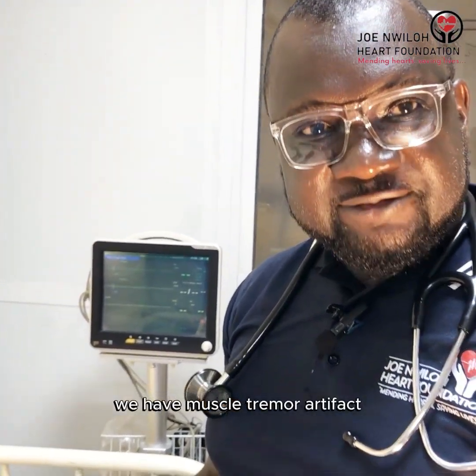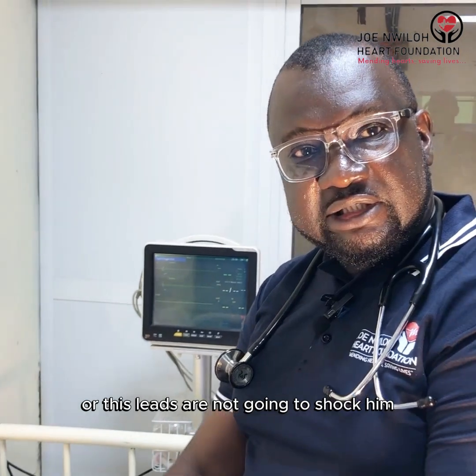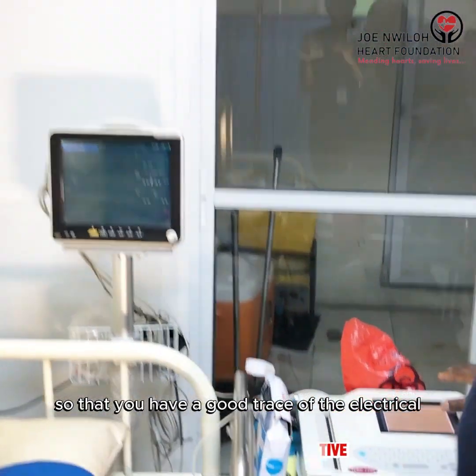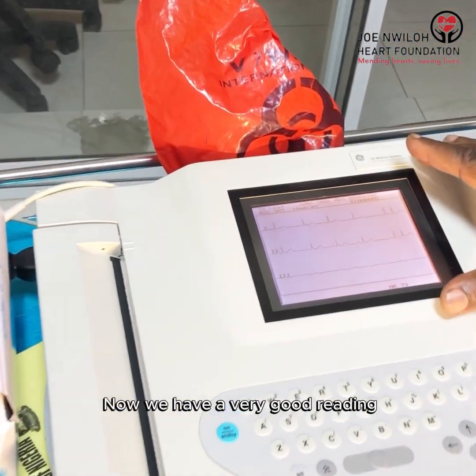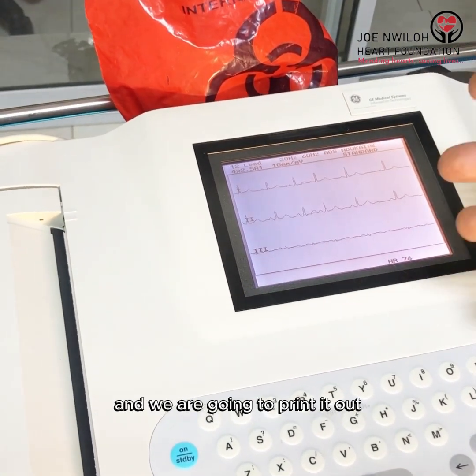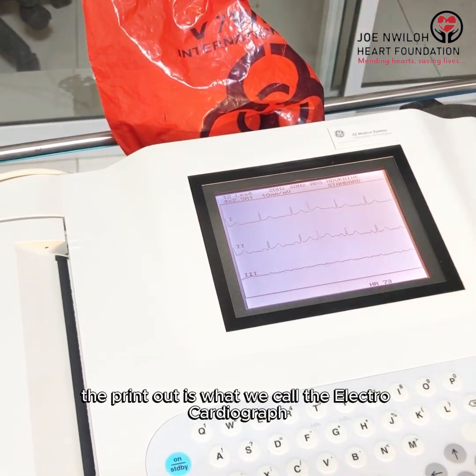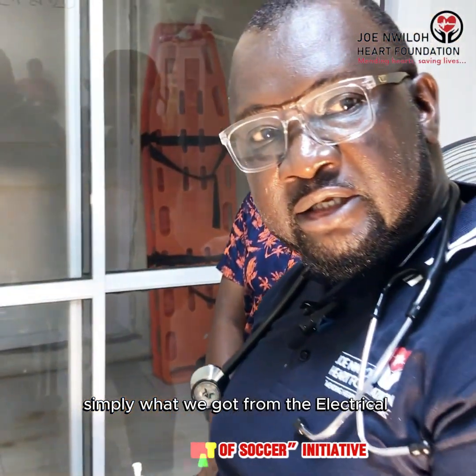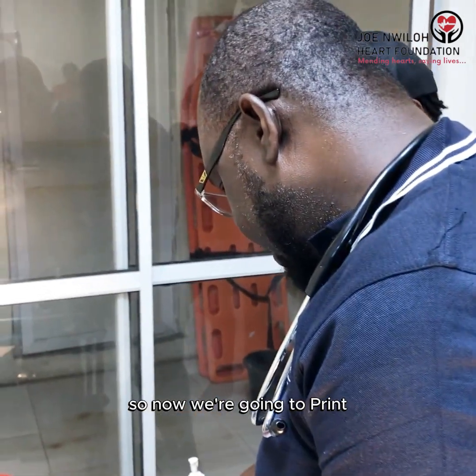We have muscle tremor artifact, electrical artifact. So when you calm the patient down, the patient has to relax, that these electrodes or these leads are not going to shock him. So the patient has to relax so that you have a good trace of the electrical reading from the machine. So as it is now, we have a very good reading, and we are going to print it out. You understand? So when we print it out, the printout is what we call the electrocardiograph, which is the result, what we got from the electrical part of the heart. You understand? So now we're going to print.